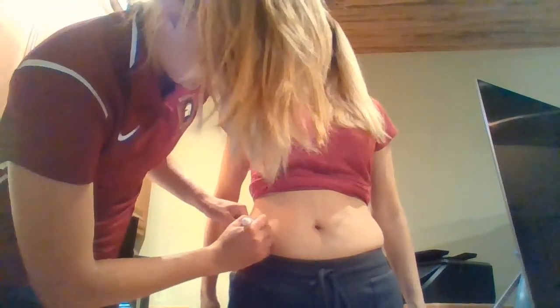All right. The next area that we're going to be looking at is the suprailiac measurement, which is going to be at the anterior axillary line just above the iliac crest. So there is a natural diagonal that follows the iliac crest, and we're going to find that. Sorry if it tickles. And once we find that, we're going to go just right above it at the belly, which is going to be right here.